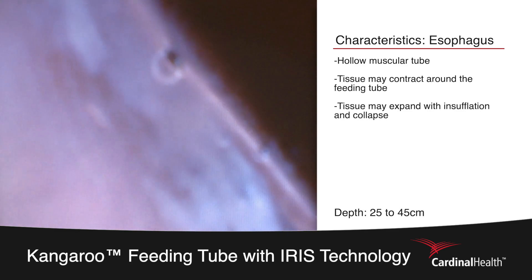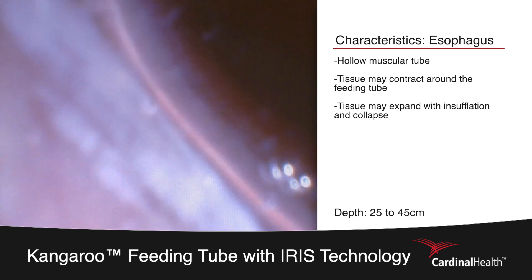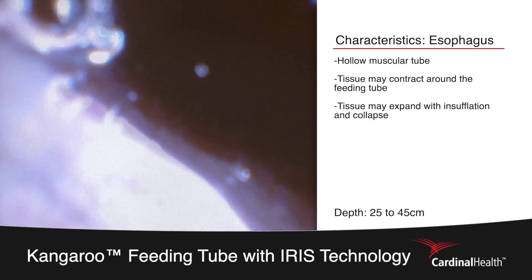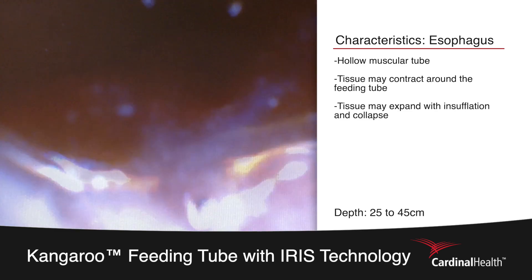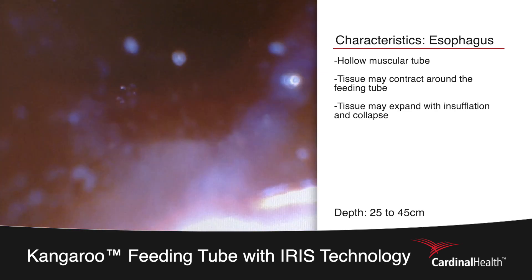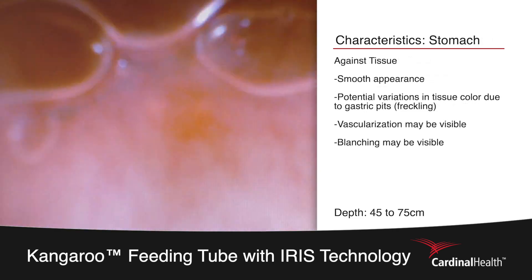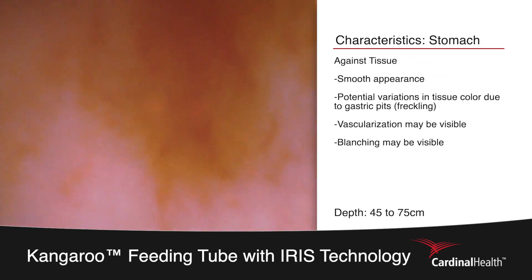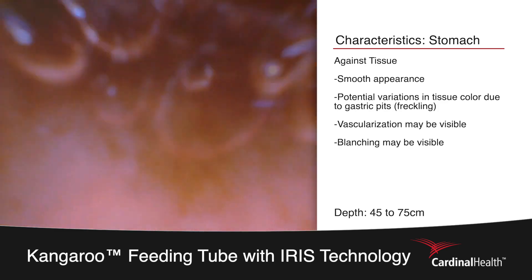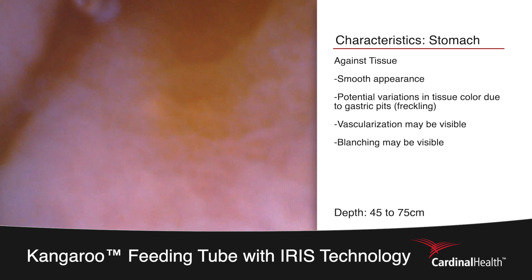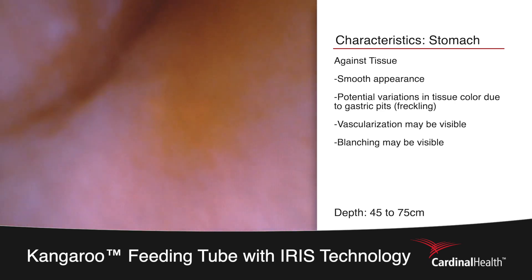Continue to progress down towards the lower esophageal sphincter to about the 50 centimeter mark, where you should be entering into the stomach. The tissue of the stomach differs from that of the esophagus. It can be easily visualized by the smooth tissue and the presence of gastric pits, which resemble freckling. We'll also be looking for a large cavernous space and the presence of rugal folds.